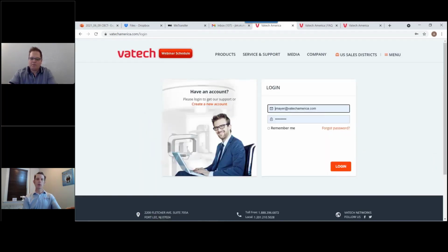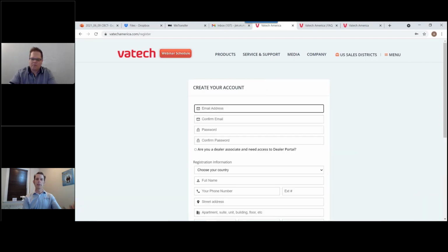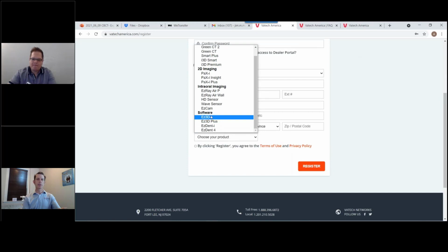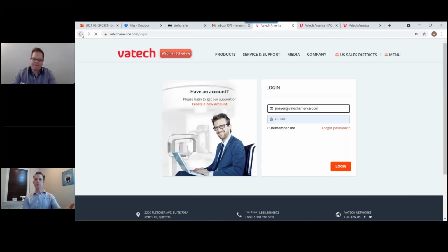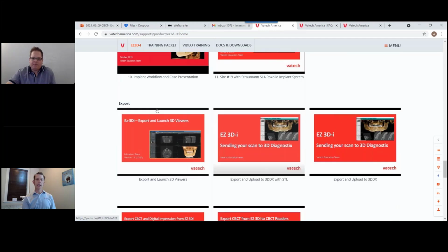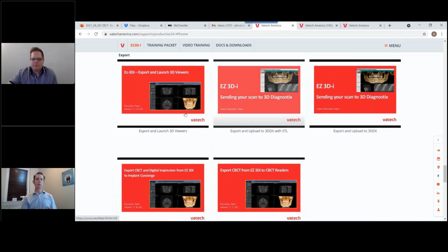If you don't have an account, go ahead and click on Create an Account, fill out your information. When you choose your product, either choose the software or your device. But if you already have an account, this will already be populated. Go to Log On, and then you can see our video training. So as I scroll down here, here's your whole host of videos that are probably about 4 minutes long.